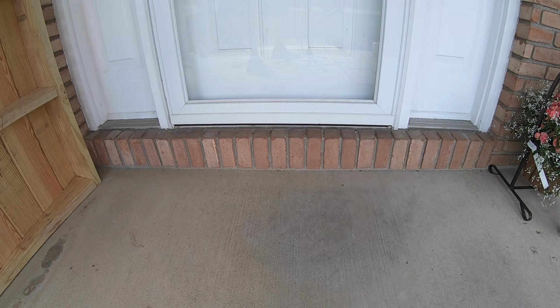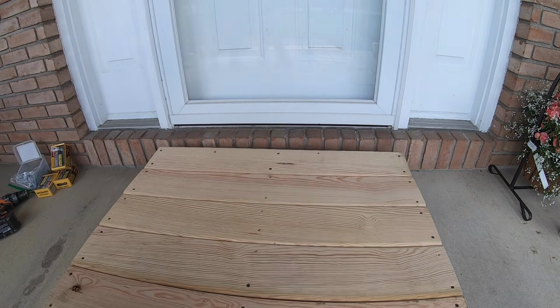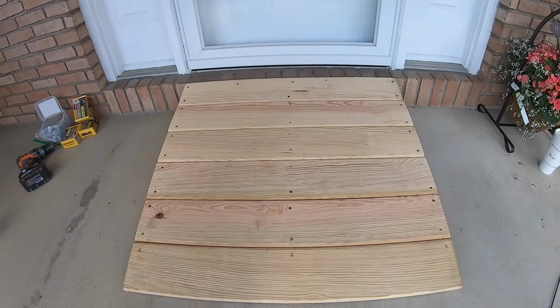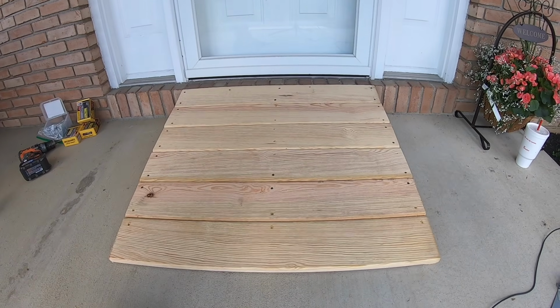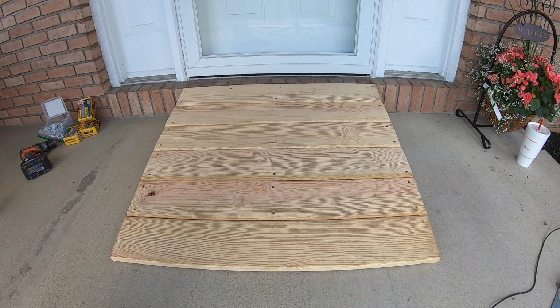Today we're going to build a removable wheelchair ramp that is not going to be placed into the brick or into the concrete. It'll kind of be a floating wheelchair ramp, and this is what it's going to look like at the end. It has the ability to be removed. It is 36 inches long by 32 inches wide and allows a person to get a wheelchair ramp all the way up and into the house pretty easily. This person did not want anything that would be bolted down because they do eventually want to sell the house. So I'm going to show you step by step all the tools and the know-how to get this project done.